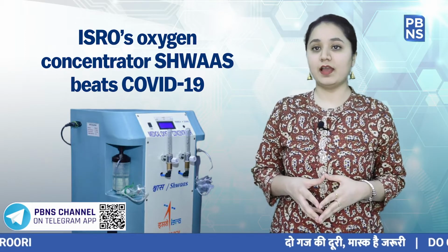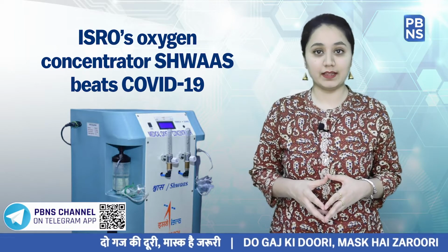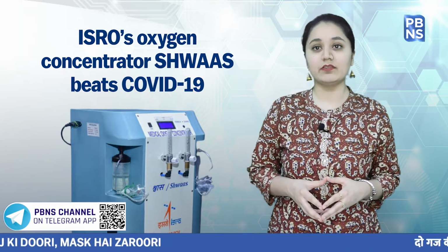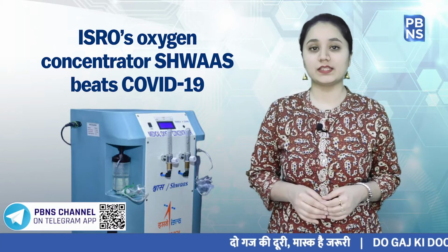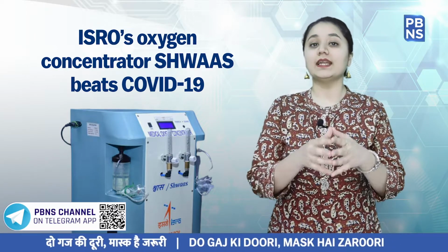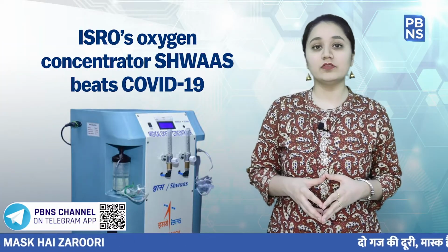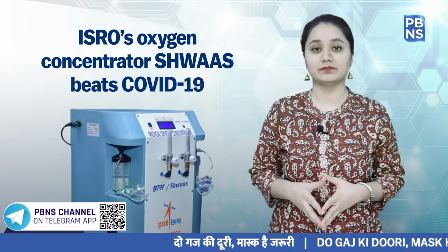It can deliver an enhanced level of oxygen than in air to support patients with respiratory illness or who are on oxygen therapy. To increase the oxygen gas content, Shwaas selectively separates the nitrogen gas from ambient air through pressure swing adsorption. Pressure swing adsorption is a technology that is used to separate some gas species from the mixture of gases under pressure. The device can continuously supply enriched oxygen adequate for 2 patients at a time.